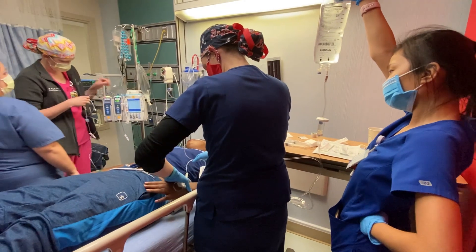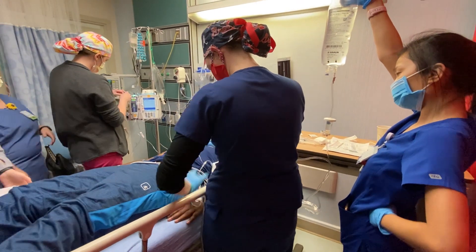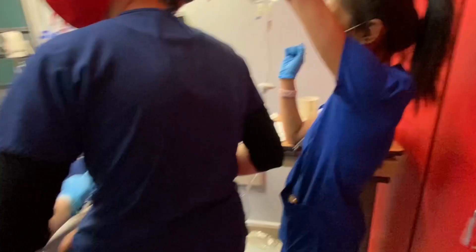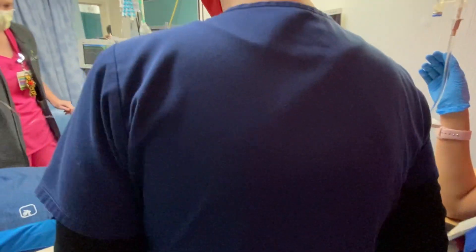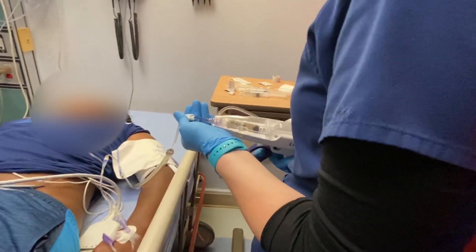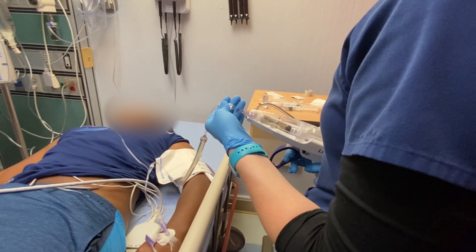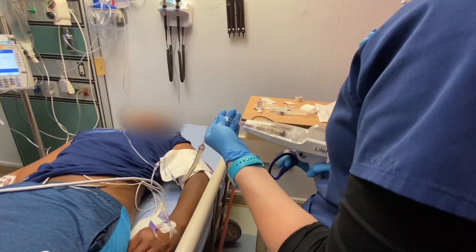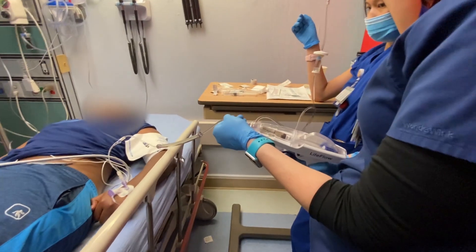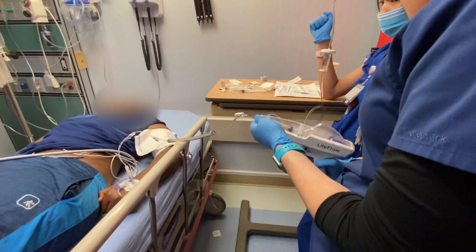We're still going with the 0.5 mics per minute, correct? A low tachycardia, but there was nothing on the EKG — the wavy baseline, but it looked pretty good. I just saw no signs of myocarditis. We're going to do 500, so go ahead and get it. We're at 1.5 an hour, right?